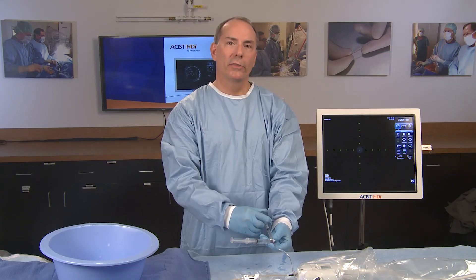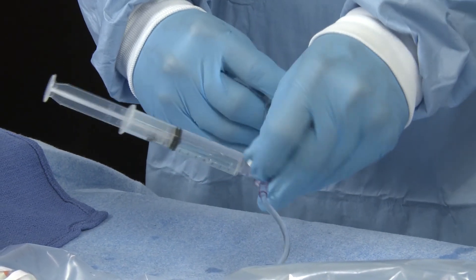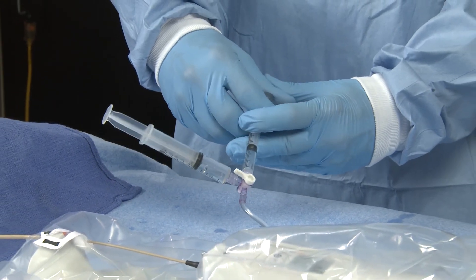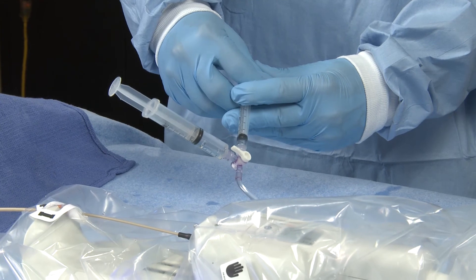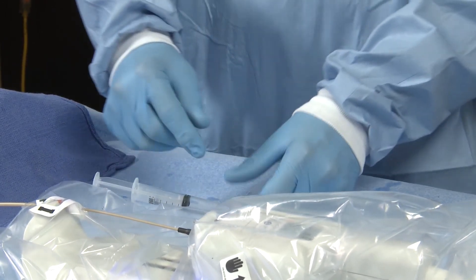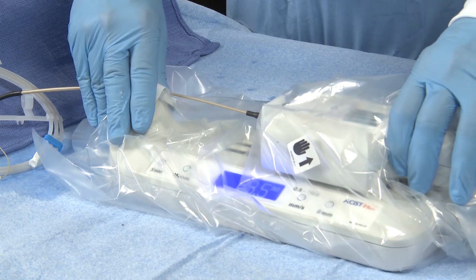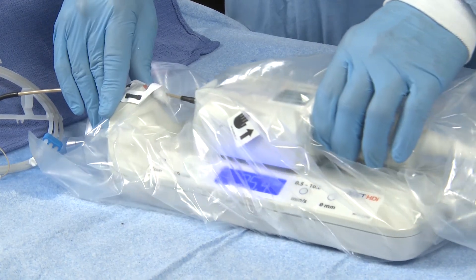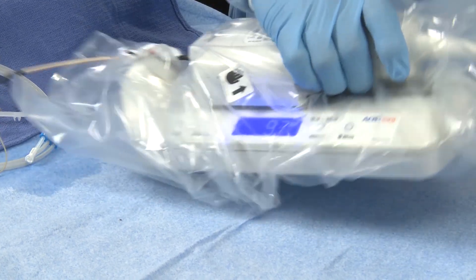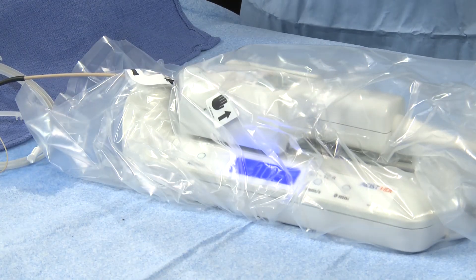Flush the Kodama catheter twice using the full 3 milliliter syringe. Press the manual button to release the PIM. Slide the PIM and LTS carriage all the way forward. Press the manual button again to lock the PIM into the forward position.